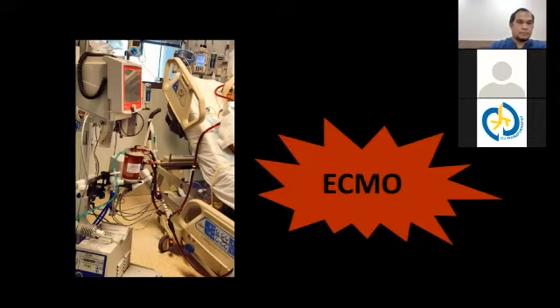When we started to see ECMO in our ICU, we used to exclude those patients from physiotherapy treatment or even intervention evaluation, because we thought that these patients were highly critical. Let's give some time for management and healing, then we will interfere.